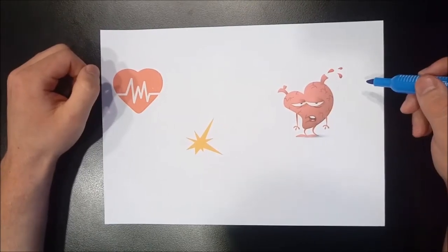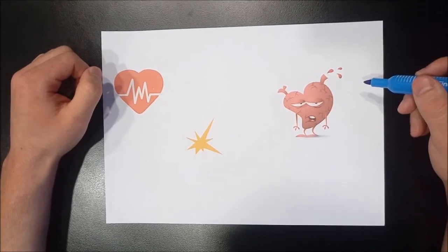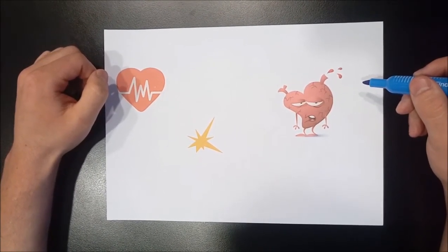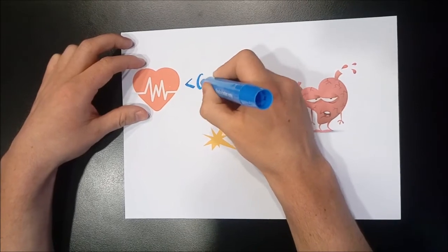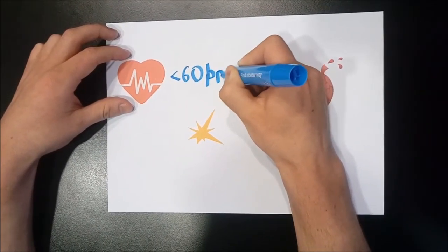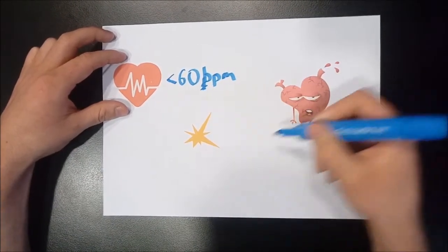A pacemaker is an electrical device designed to assist in the monitoring and controlling of a patient's heart rate. Doctors recommend pacemakers to patients with an abnormal heart rate known as an arrhythmia. Pacemakers are mainly used to treat bradycardia, a heart rate below 60 beats per minute, which is generally the result of a problem with the heart's electrical system, such as in the case of heart block.